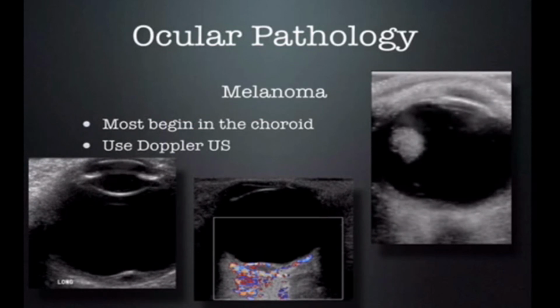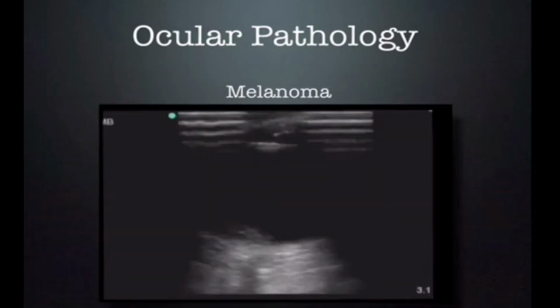It can be a little bit challenging to see if it's very smooth or flat, but when you're looking, sometimes you will see these bumps. Turn on Doppler, see if there's blood flow around it. If it's not in a TB endemic area, it's more than likely a melanoma.